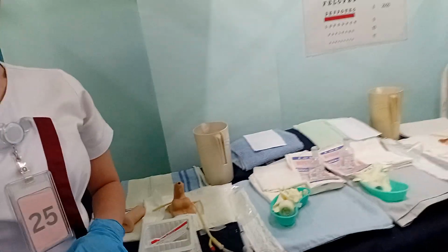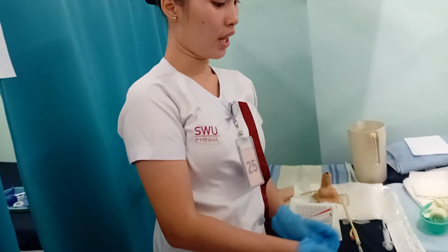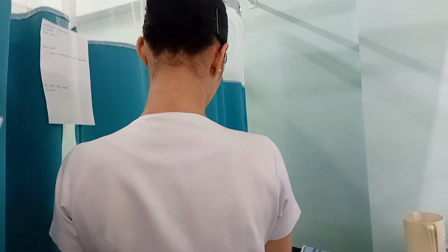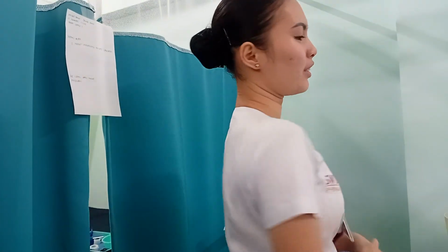Assuming that you're done with attaching the urine bag, what will you do with your materials? After, we are going to dispose of all the materials properly. Remove the gloves, and then we're going to perform hand washing. And then what will you do with the patient? We're going to reposition our patient. And then finally, we're going to document the procedure and the assessment.